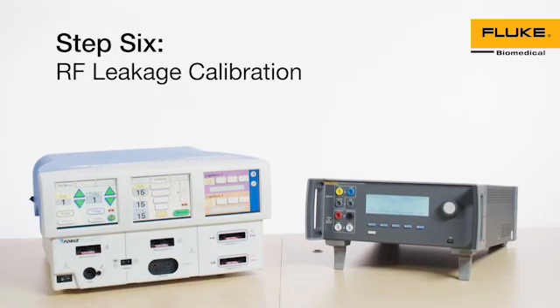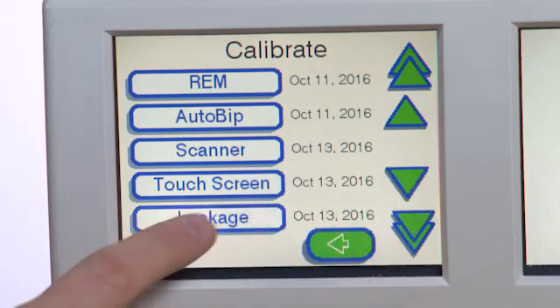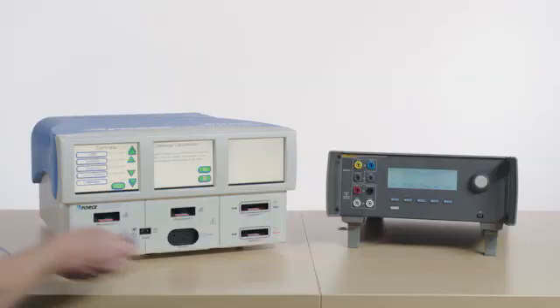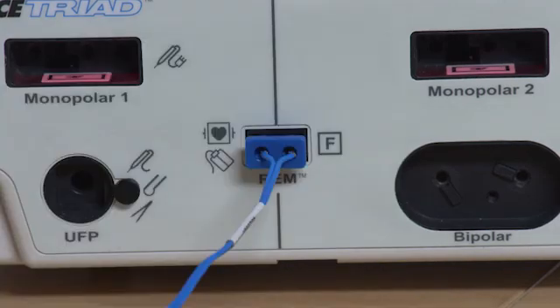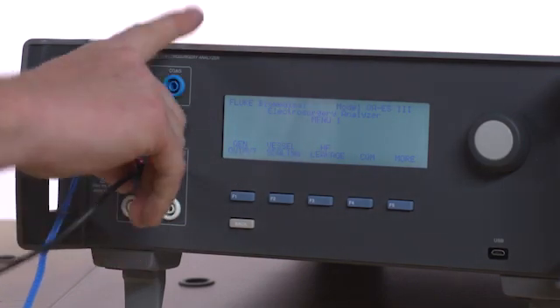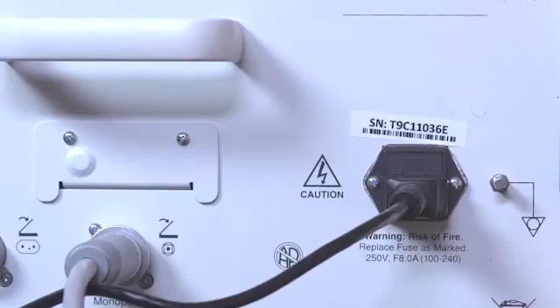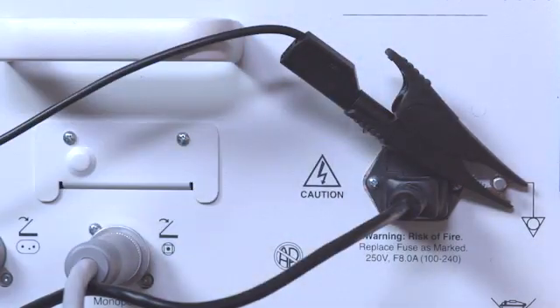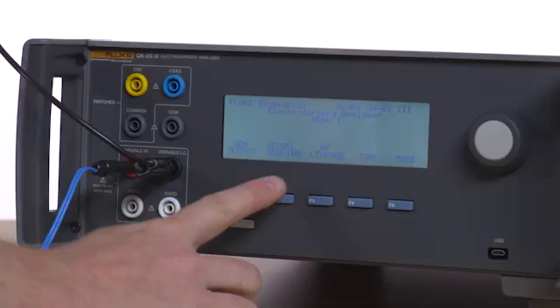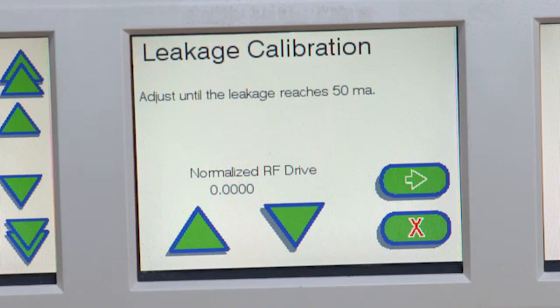Step 6: RF Leakage Calibration. Select Leakage Calibration from the Calibrate menu. Connect the ESU dispersive safety lead to the REM port on the Force Triad and then to the variable high port on the QAES-3. Connect the black test lead from the variable low port on the QAES-3 to an alligator clip and attach it to the ground lug on the rear chassis of the Force Triad. Press F2 on the QAES-3 to enter vessel sealing mode. Select 0 ohm load. Press F4 for start continuous. Select the Next button on the Force Triad to continue.